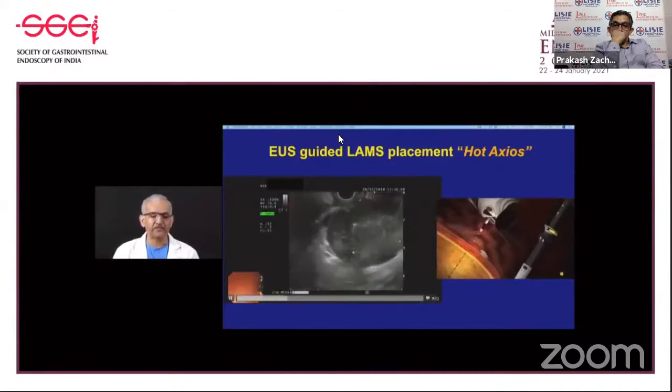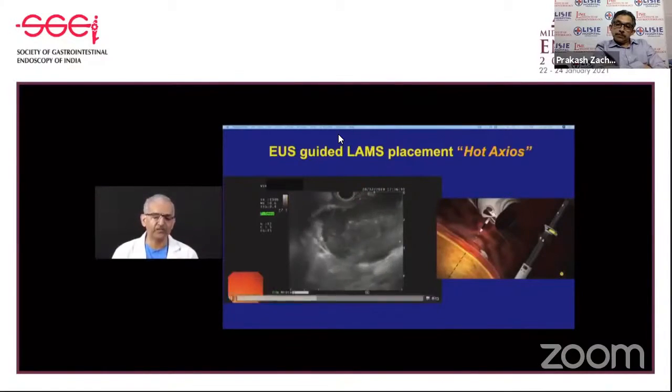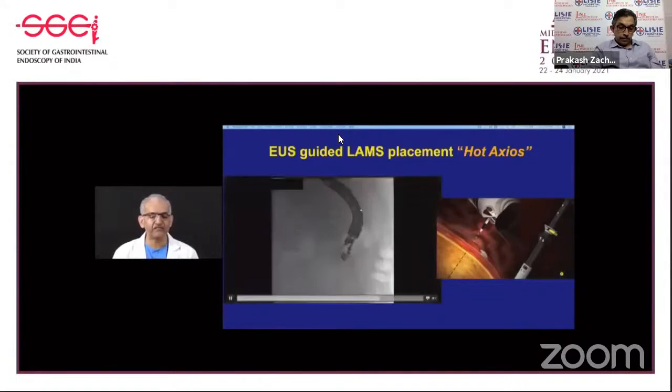device, which has 4 steps marked on the assembly itself. The first is puncturing with high cautery intensity, pure cut or auto cut mode of 100 watts, avoiding the blood vessel in between, which is what I'm doing now. And once we are inside, then we go to the second step of releasing the inner flange. As you can see here, the inner flange has got released. And then we go to the third step and we pull back the sheath of the assembly so that the stent inner end gets a little deformed.